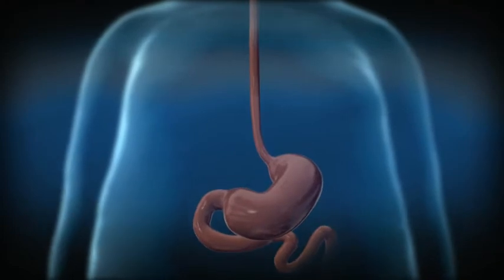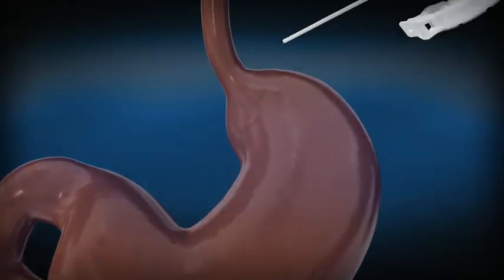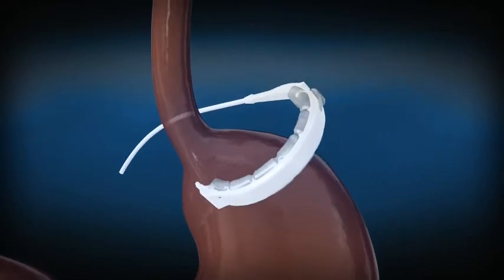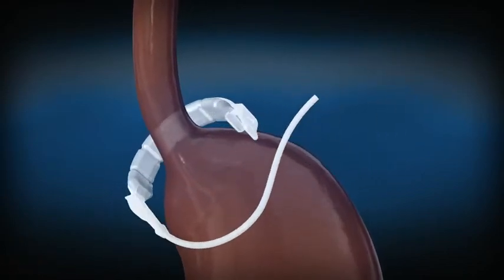The LapBand system surgery is usually performed laparoscopically. The device is inserted through one of five or six small incisions and is wrapped around the upper part of the stomach.